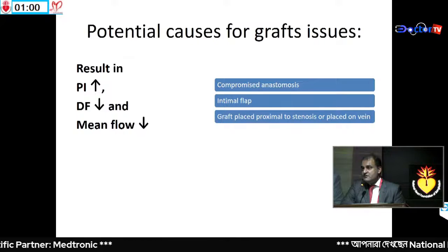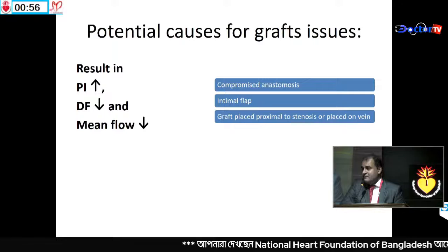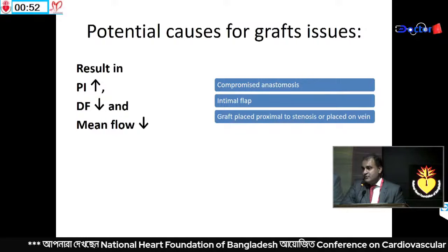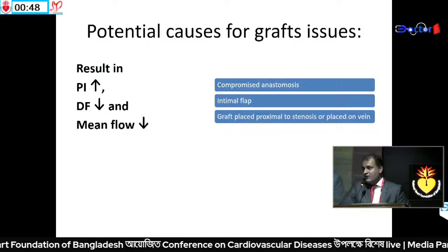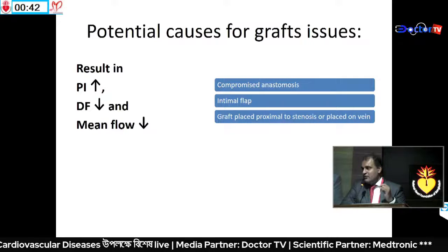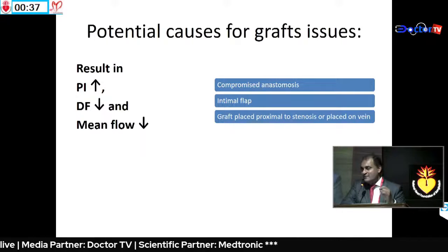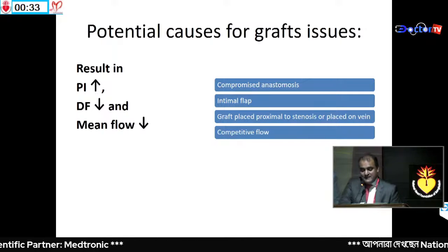So once one of the registrars had a 500 ml per minute flow, he called the consultant to boost that. What a fantastic job he has done. The vessel has 500 ml of flow. All of us who do cardiac surgery know that you cannot have 500 ml per minute flow in a LAD. He essentially put it on a vein. That's why the flow was so high. That was identified because of this machine. So the consultant scrubbed up and did the case.